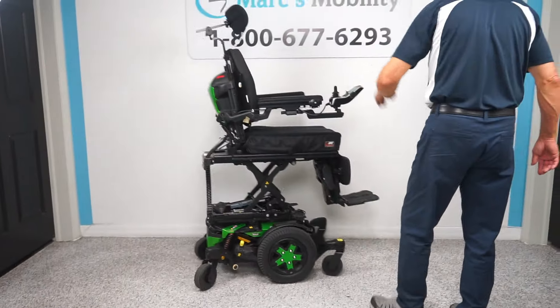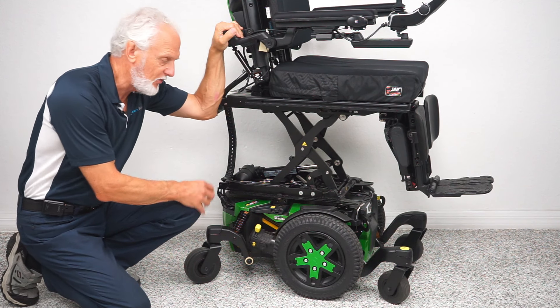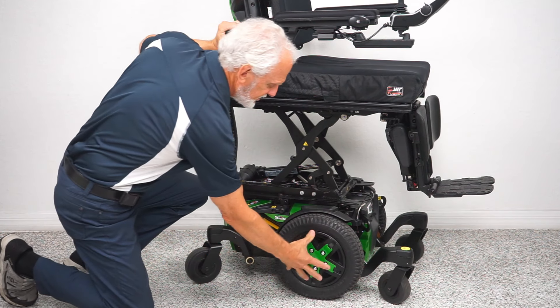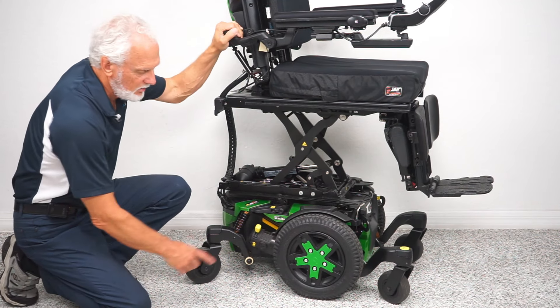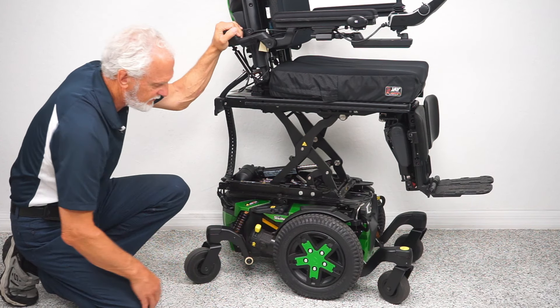Let's look at the base on this chair. It's a gorgeous power chair, folks, and it's built like a tank. This chair weighs probably somewhere close to 425 pounds, so it's a heavy power chair. This is considered a mid-wheel drive chair. Mid-wheel drive means your drive wheel — your big wheel — is going to be between the other two wheels. These are 14-inch tires and they're not going to mark your floor.